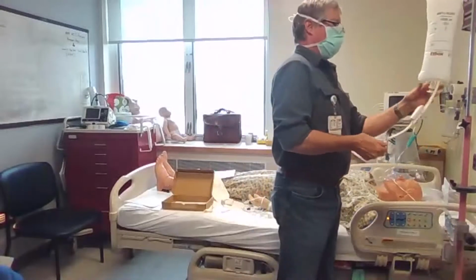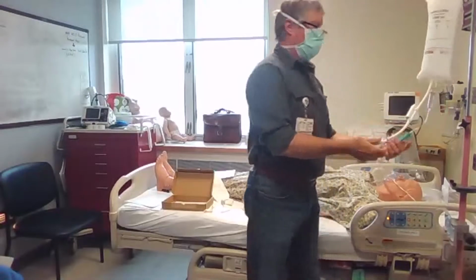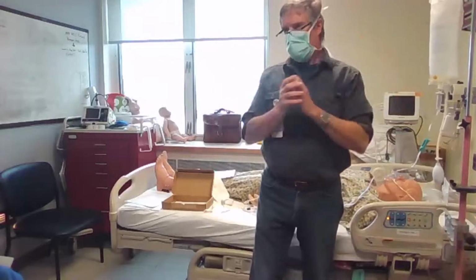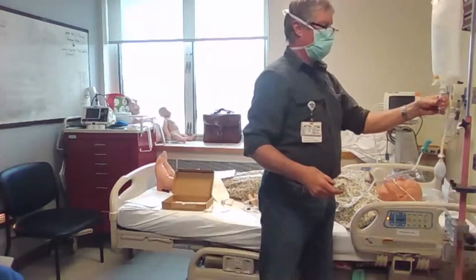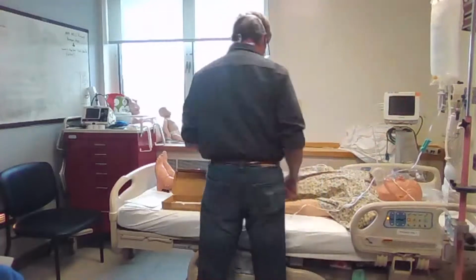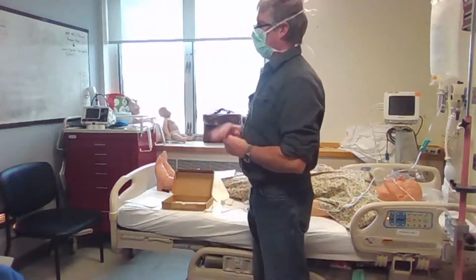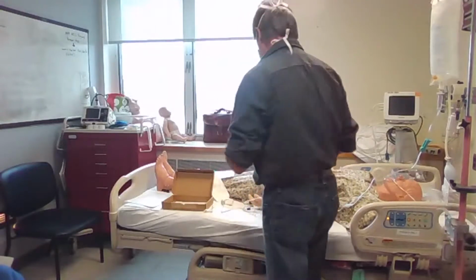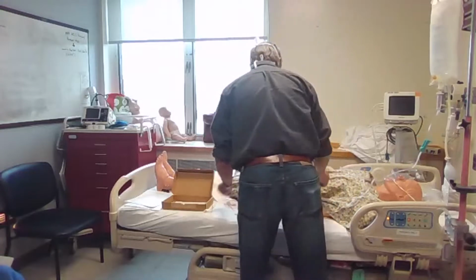I'm not gonna turn it all the way up. Typically you're gonna start getting a drip. Once it starts dripping, you can probably prime it, because when you put it all the way up and prime it, it causes turbulent flow to come through the needle, and it's gonna entrap air. So if you do it with less than 100. In a regular IV line, you can get those little tiny microbubbles. You want to try to eliminate all of that if you can. You don't have to be crazy about it, but you do wanna try your best, because it makes everything work a lot easier.